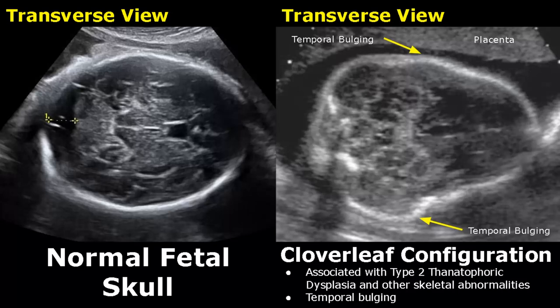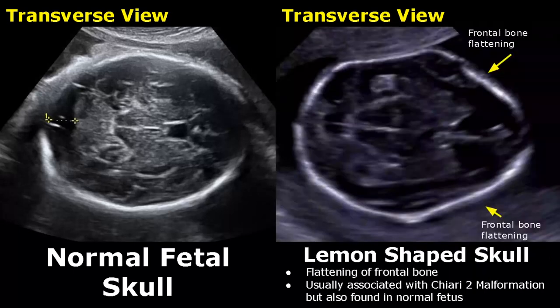A lemon-shaped skull occurs due to flattening of the frontal bone. It is usually associated with Chiari 2 malformation, but sometimes is also found in a normal fetus.